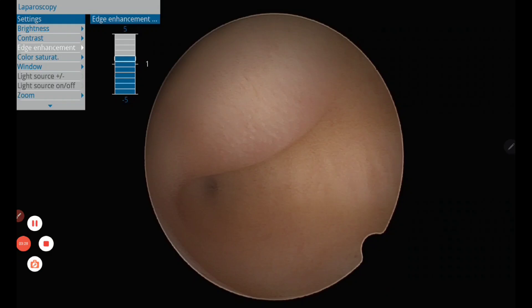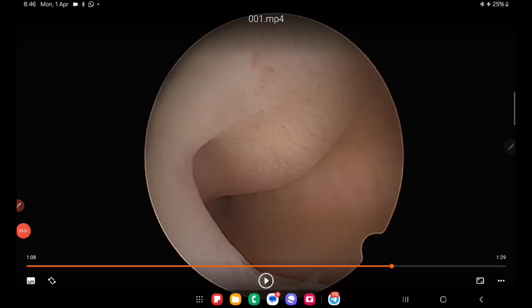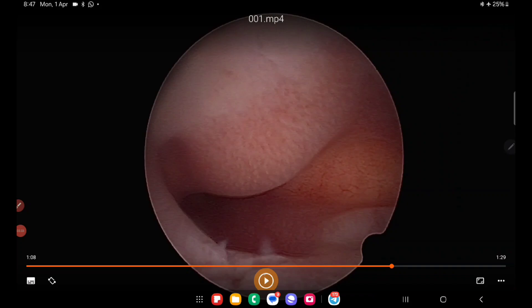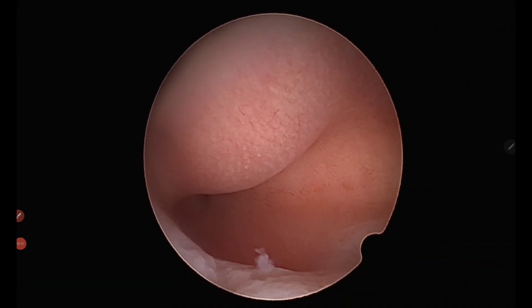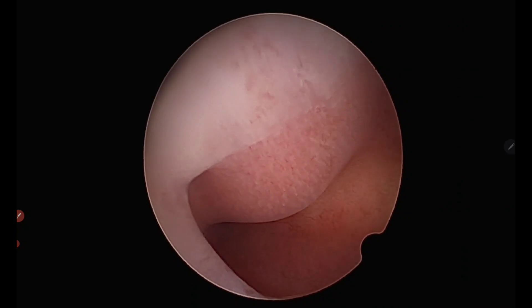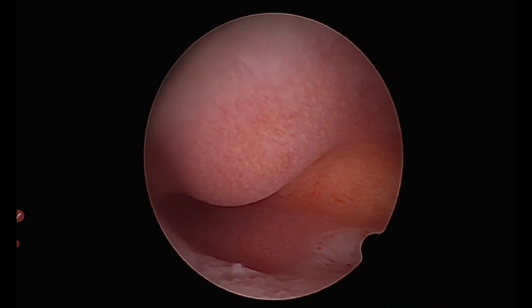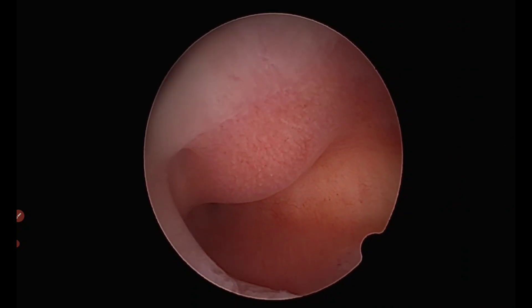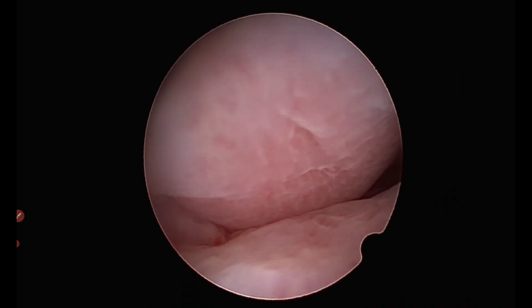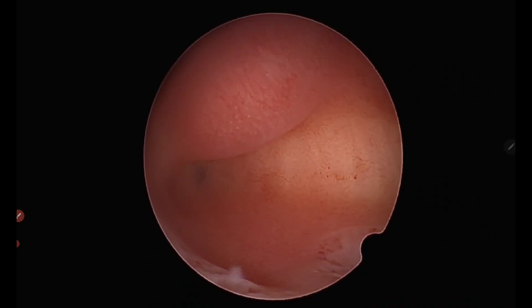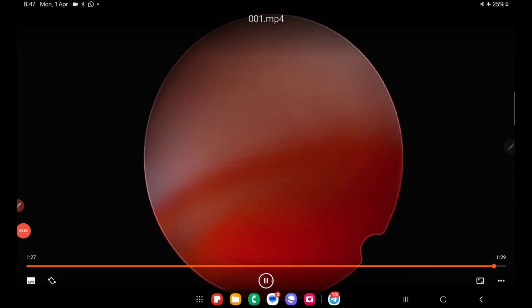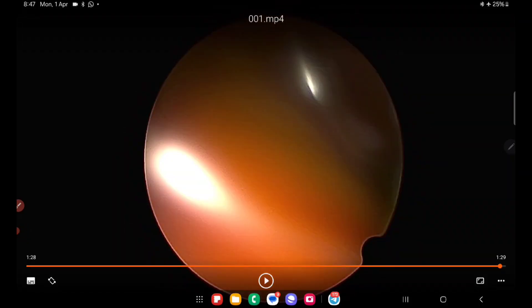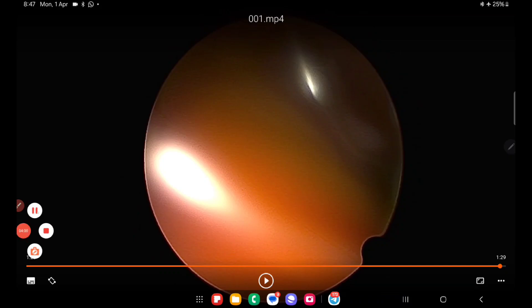Before starting the operative part, we reduce the distension pressure. With reduced distension pressure, you can clearly see how the fibroid bulges inside the uterine cavity — confirming what the sonologist reported as a type 0 or type 1 fibroid. You can see how beautifully it gets pushed out of the uterine cavity because of the distension pressure. This concludes the diagnostic part; now we move to the operative phase.